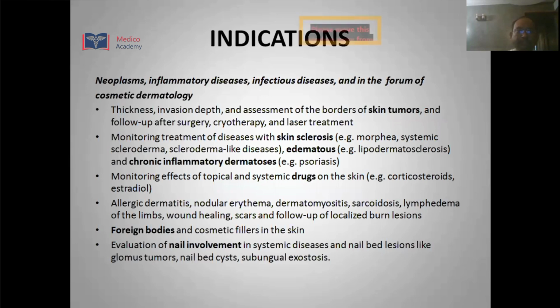So the basic indications are neoplasm, inflammatory diseases, infectious diseases, and cosmetic dermatology. The thickness, invasion depth, and assessment of the borders of skin tumors, and follow-up of surgery, cryotherapy, and laser treatment. Then there is also monitoring treatment of diseases with skin sclerosis such as morphea, systemic scleroderma, and edematous and chronic inflammatory dermatosis. Monitoring effects of topical and systemic drugs on the skin such as corticosteroids and estradiol.